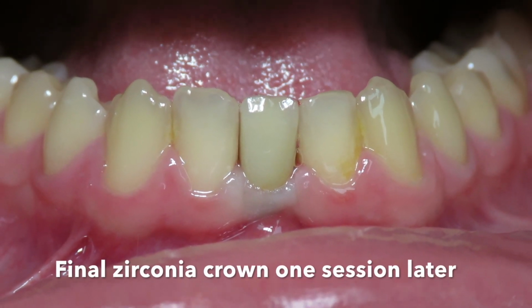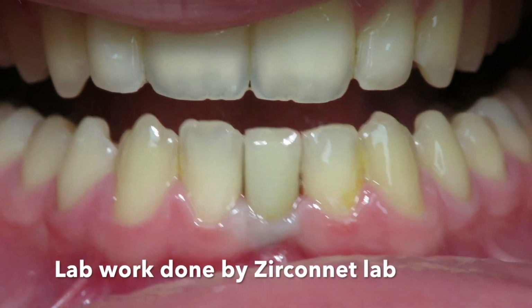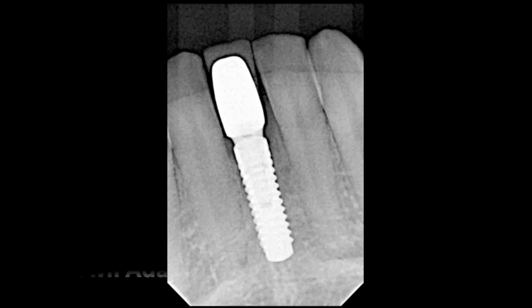And here you can see the final placement of the zirconia crown. The aesthetic is highly acceptable. The fit is very nice. You can see it on the X-ray. And I think this is a very reliable procedure to be performed.